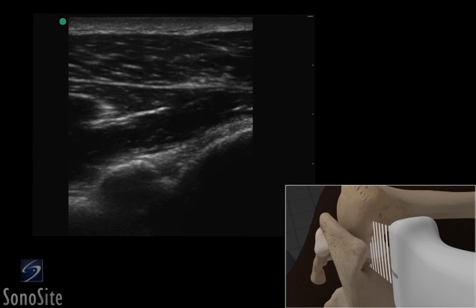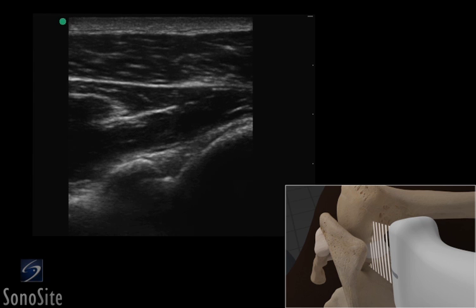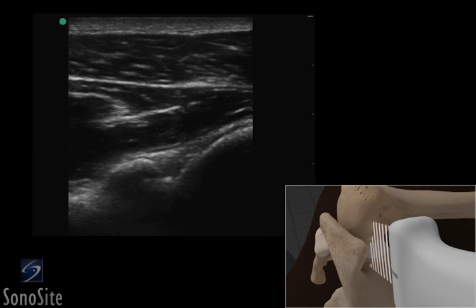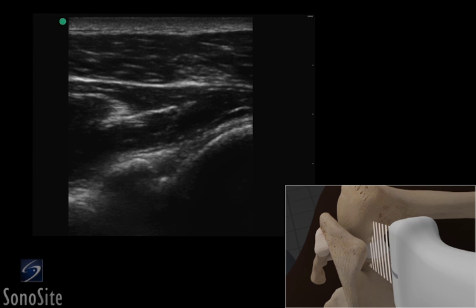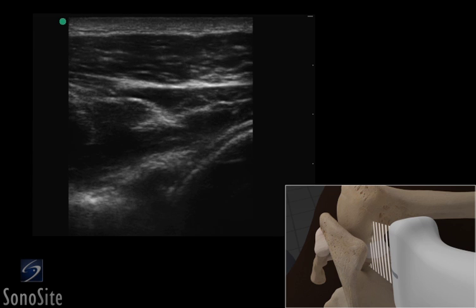A linear array transducer with a musculoskeletal exam type is used to perform an ultrasound-guided injection of the shoulder joint via a lateral approach. Alternatively, a curved array transducer with a musculoskeletal exam type can be used in a large patient.